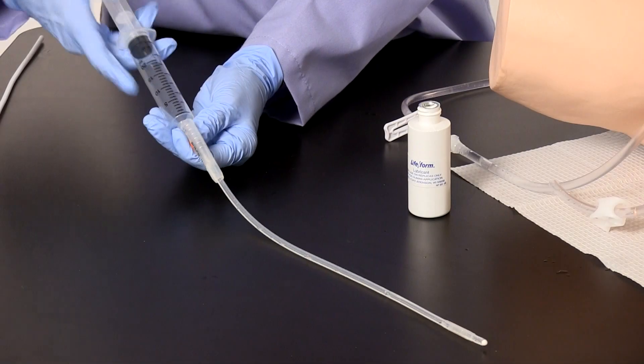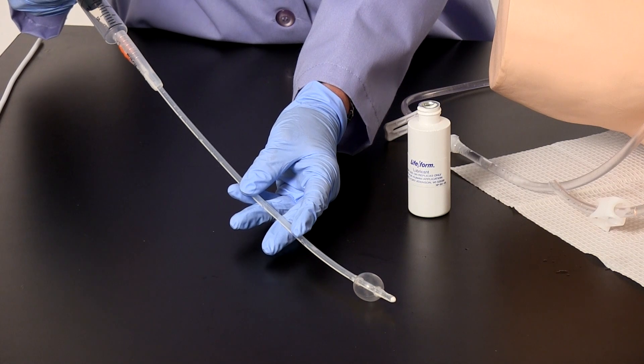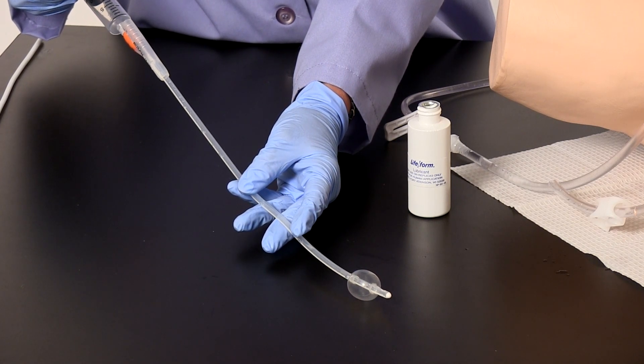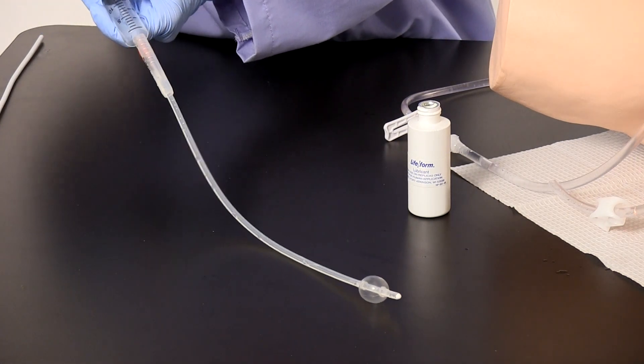Properly inflating and deflating the catheter. Special care should be taken when using a Foley catheter. Cuff inflation should only be attempted when it is in the proper position inside the bladder. The cuff must be completely deflated before the catheter is removed.